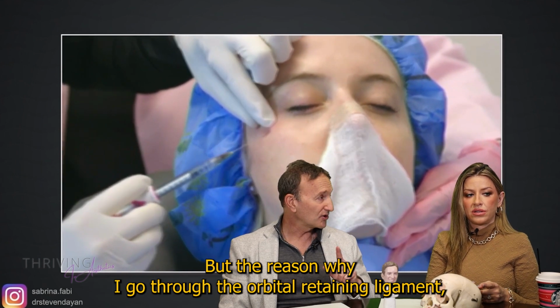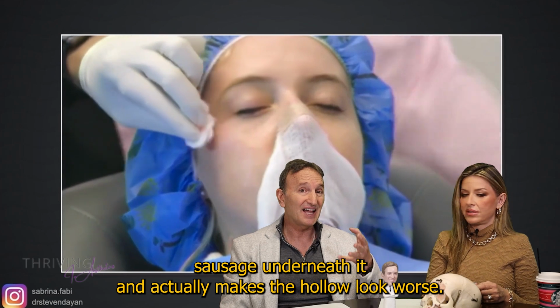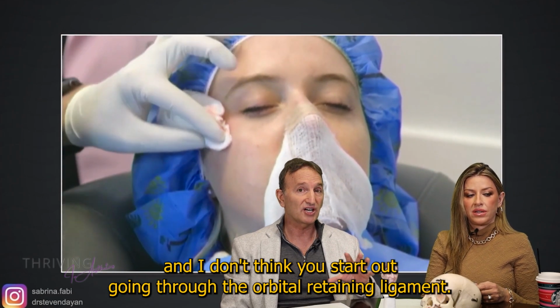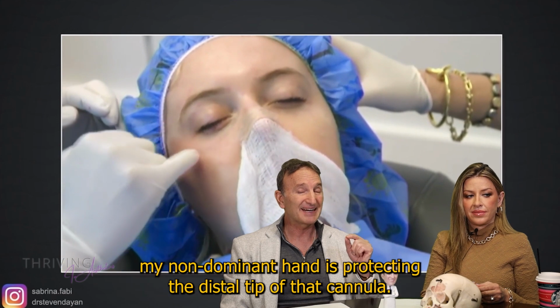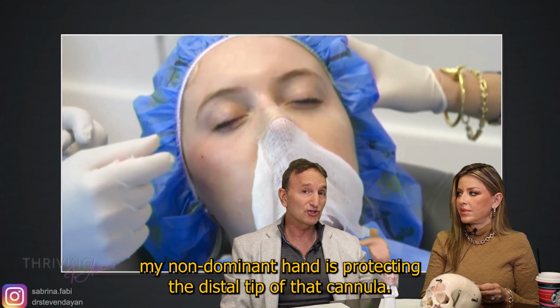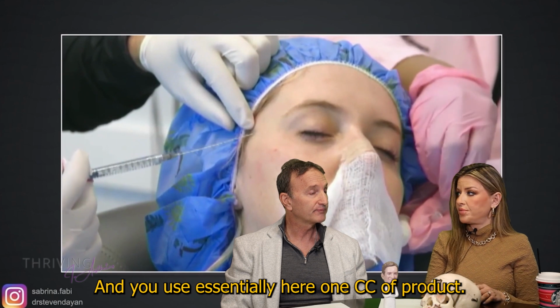But the reason why I go through the orbital retaining ligament is because if I don't do that, then you get a little sausage underneath it, and it actually makes the hollow look worse. So this is an advanced technique. I'm not saying that everyone should do this, and I don't think you start out going through the orbital retaining ligament. But I do pop through, and for those people who are a little more advanced, you have to pop through. But my non-dominant hand is protecting the distal tip of that cannula, so it doesn't go intraocular. And you use essentially here 1 cc of product.